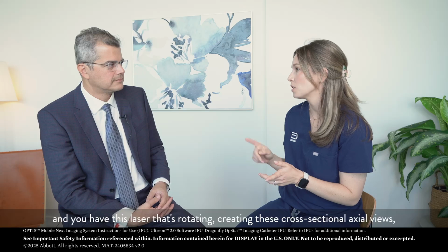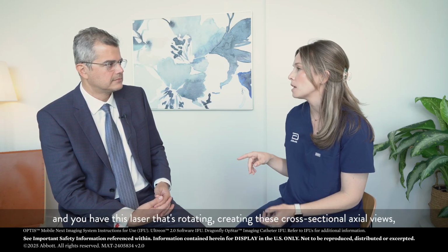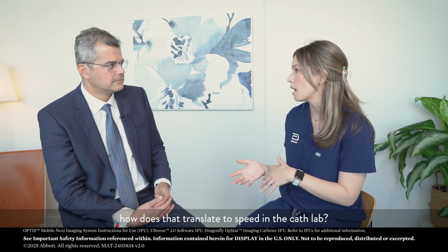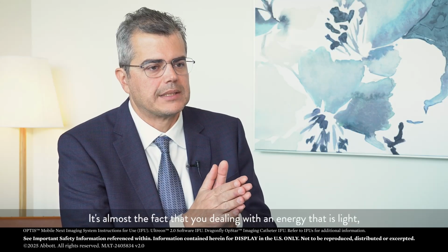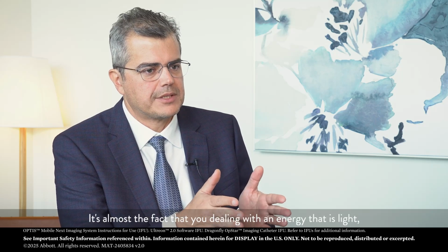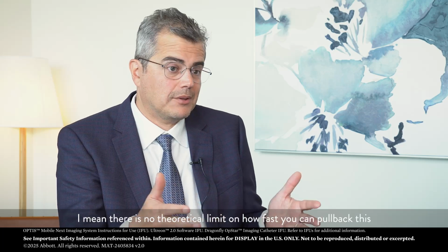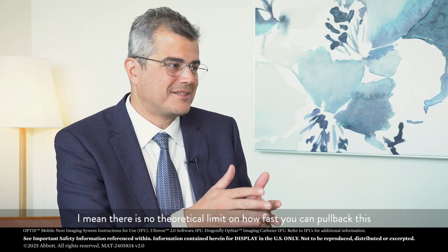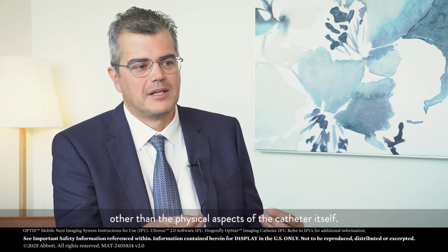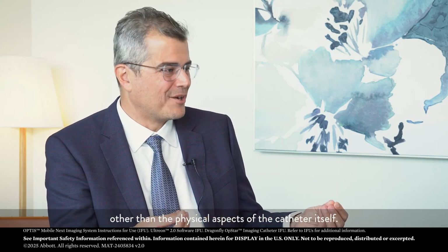Putting all of this together in terms of the physics and the principles of how OCT works, and you have this laser that's rotating, creating these cross-sectional axial views, how does that translate to speed in the cath lab? The fact that you are dealing with an energy that is light means there is no theoretical limit on how fast you can pull back, other than the physical aspect of the catheter itself, right?